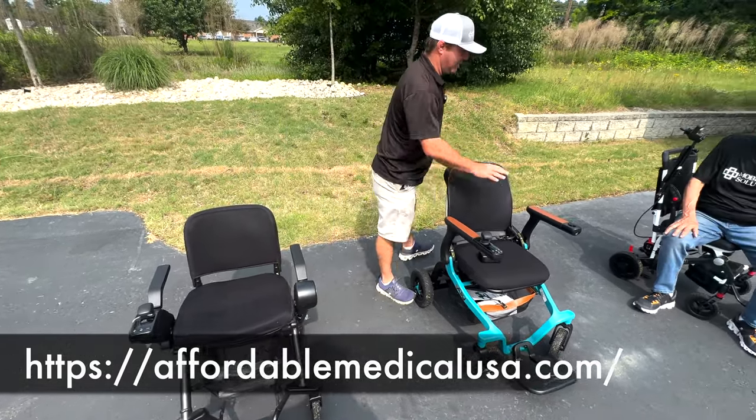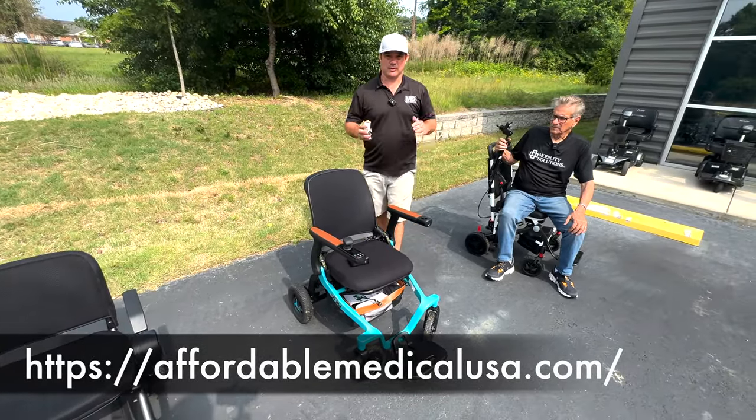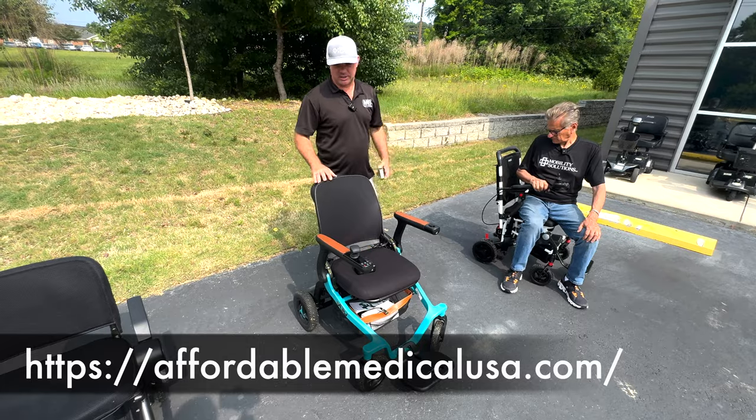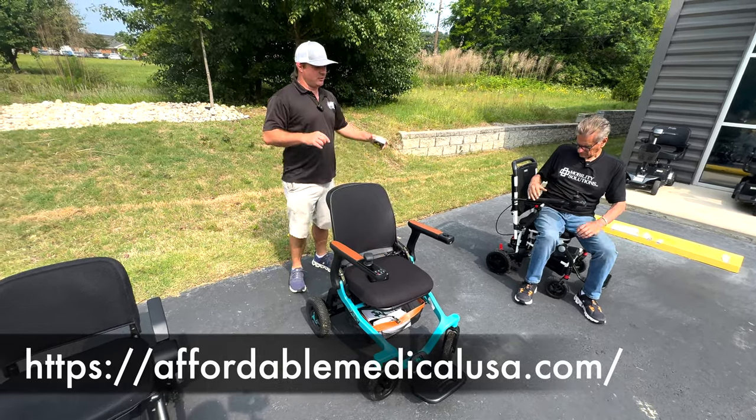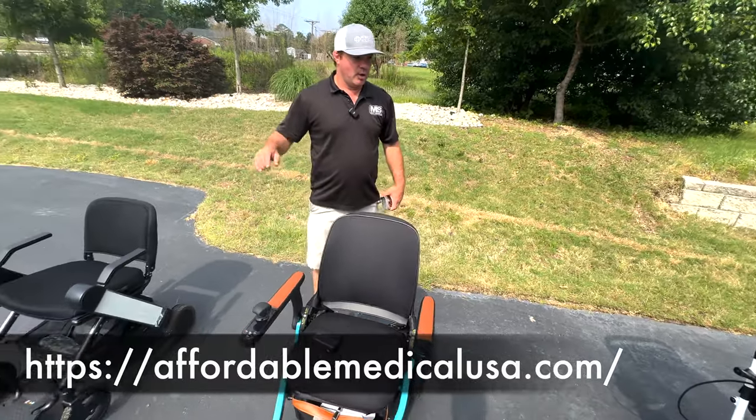This one's stationary, that one's stationary. This can be moved from right to left too. So if you're a left-hander, all these chairs could be moved over. The easiest one to move would be that one. This one would be second, this one would be third.